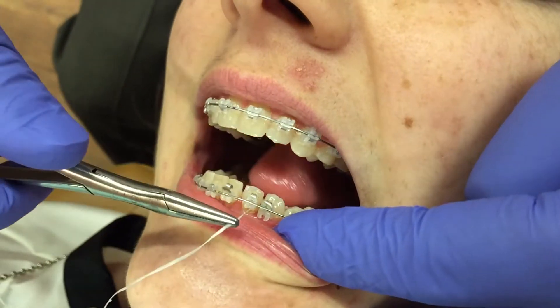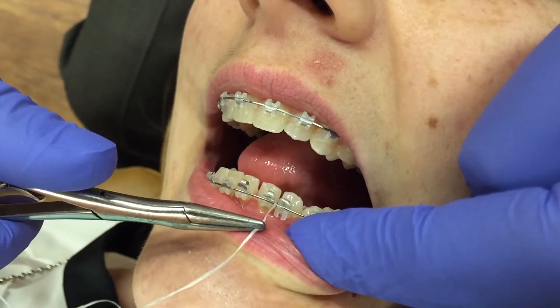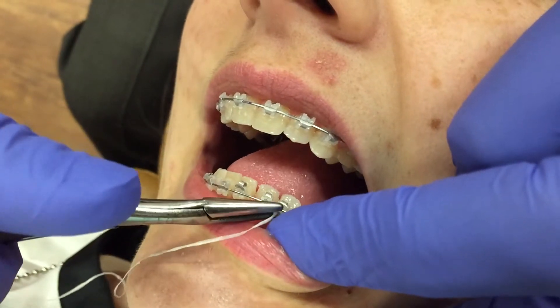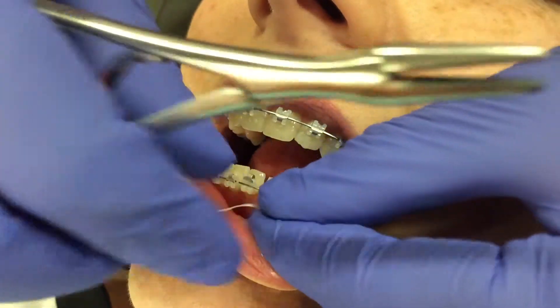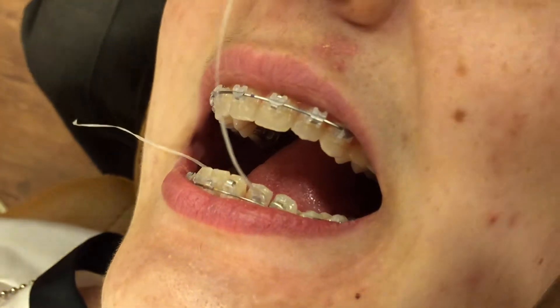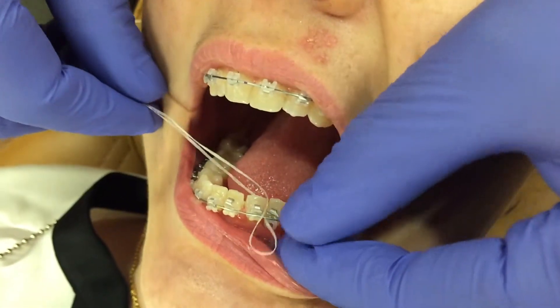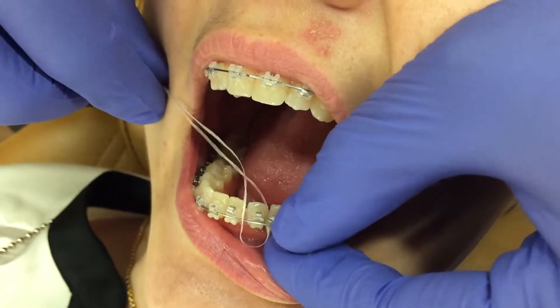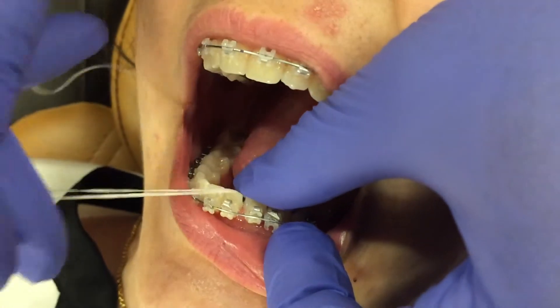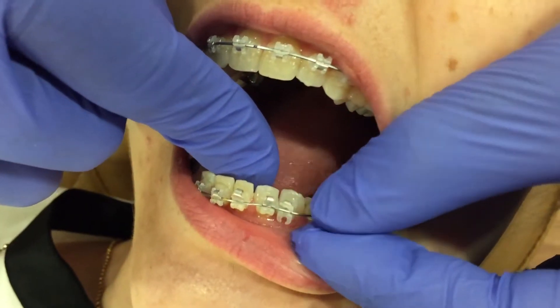We're going to use the floss method to engage a wire in a rotated tooth. Gently feed the floss through right under the contact, then take the other piece and also put it through the contact. Make sure you have a firm grip on the floss.